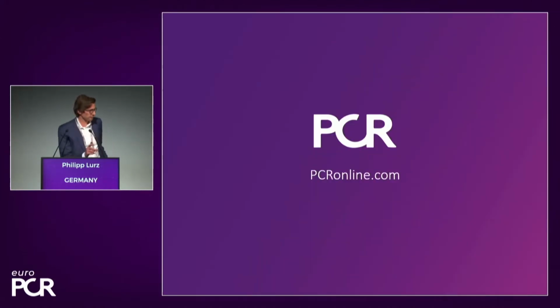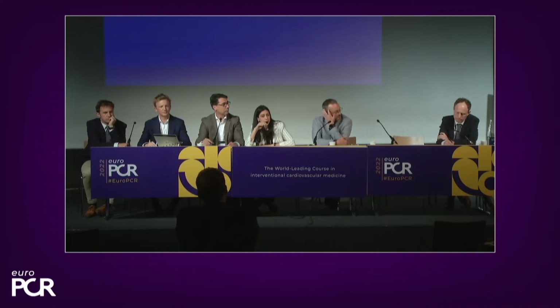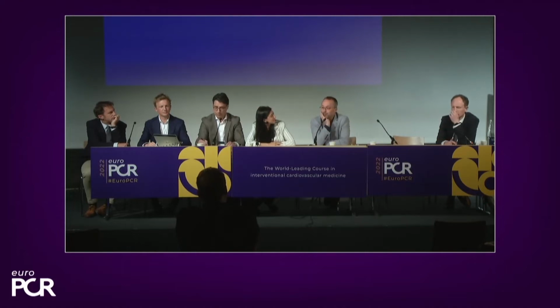Thank you, Philip. It's an interesting case. We will be waiting to see how you treated it. But in the meantime, I want to see with the panel, would you also have gone directly to a transcatheter approach, Jörg? Well, I was joining the procedure, so of course I would have done the same. Conflict of interest. Let's switch to somebody else. Wolfgang.